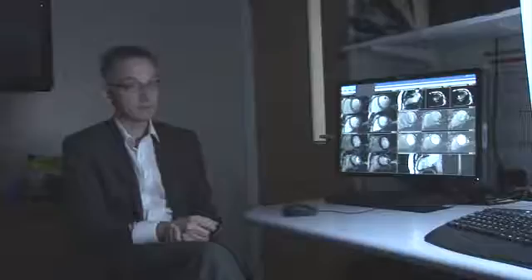And what do you feel about doing stress and rest as part of your protocol? Is it something that you normally do or not?